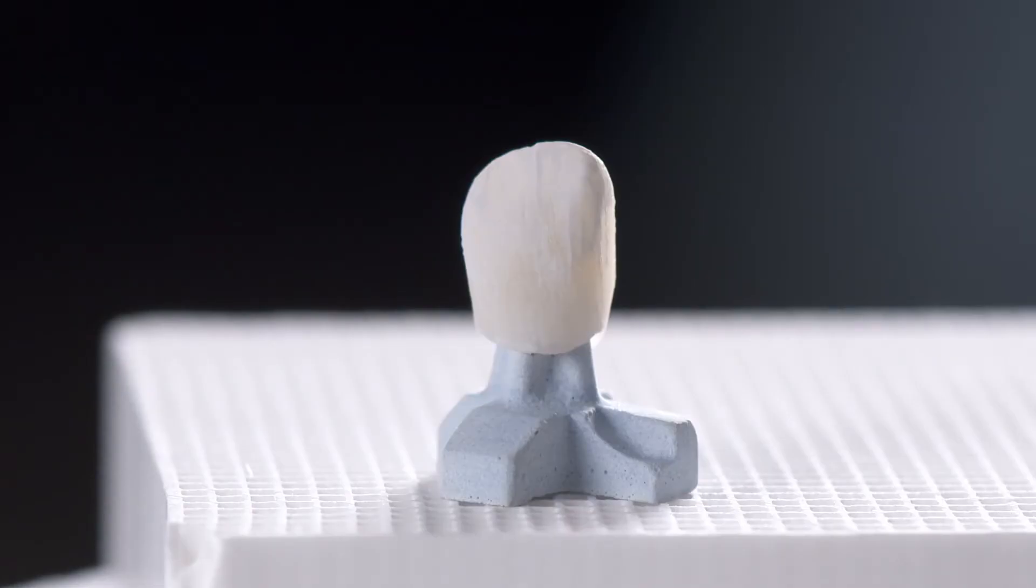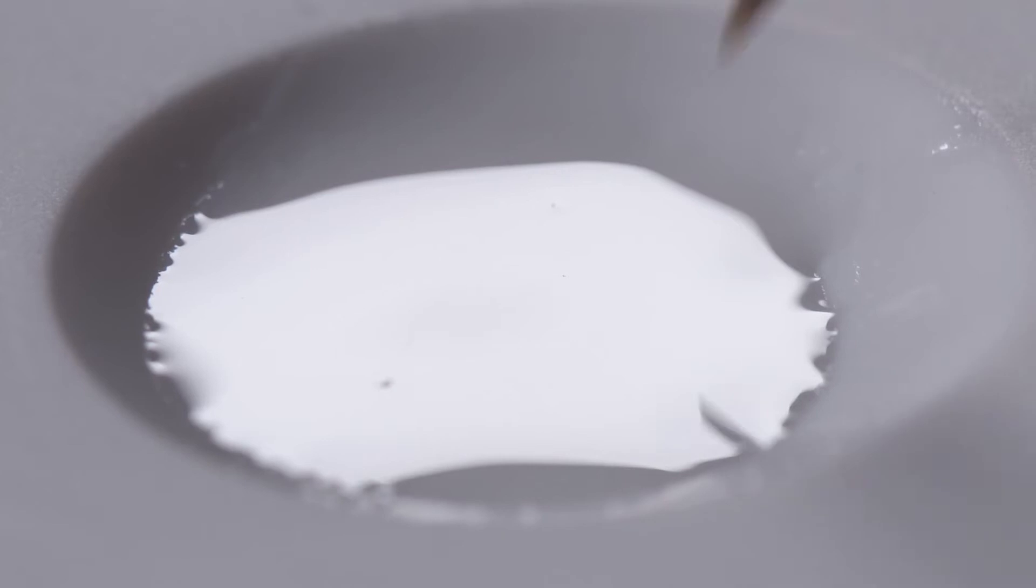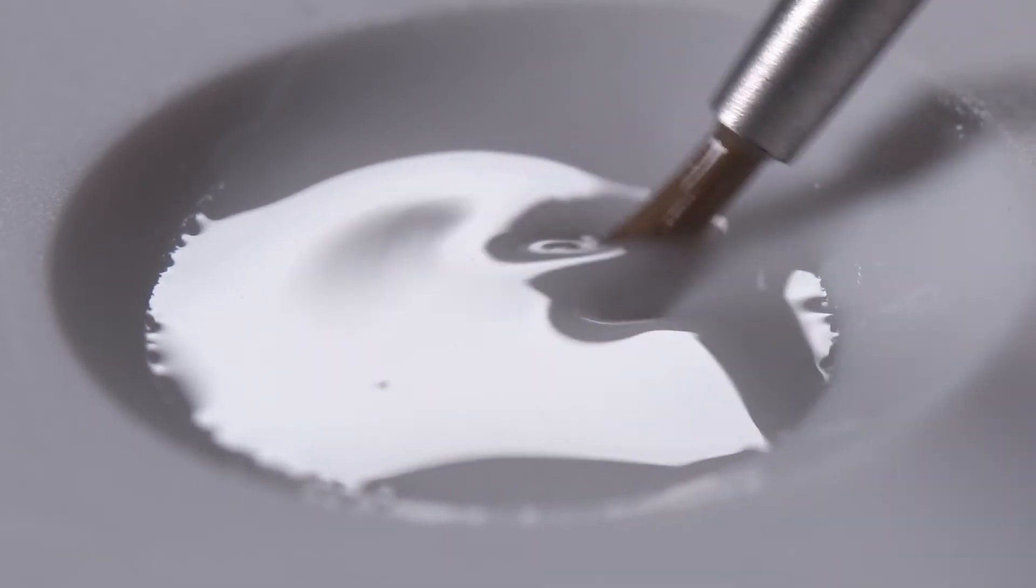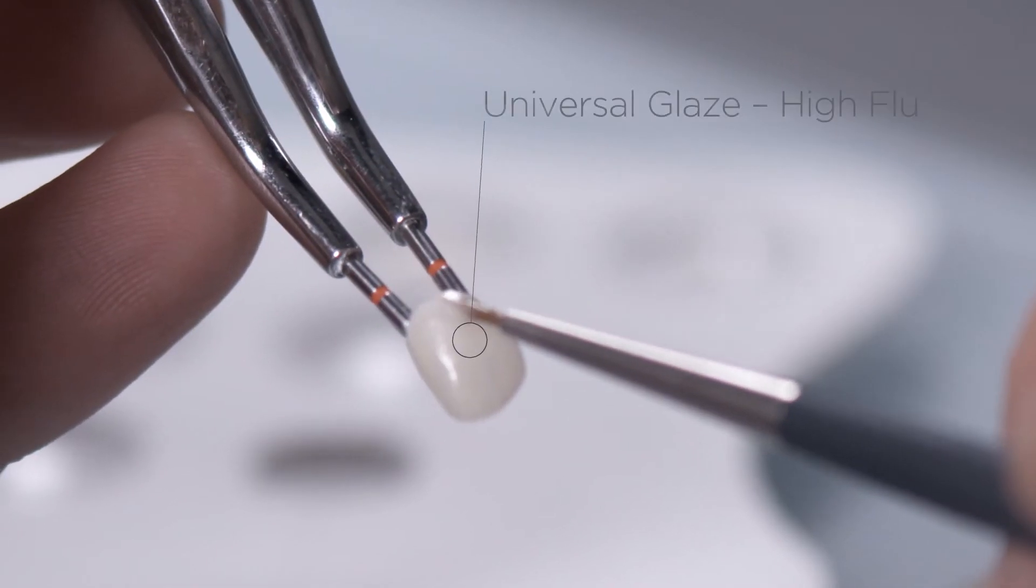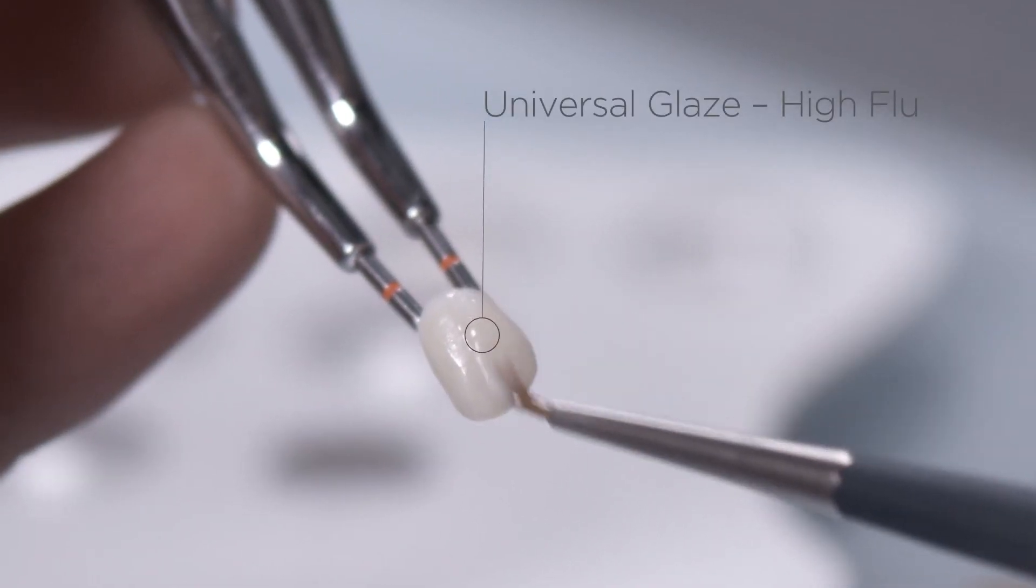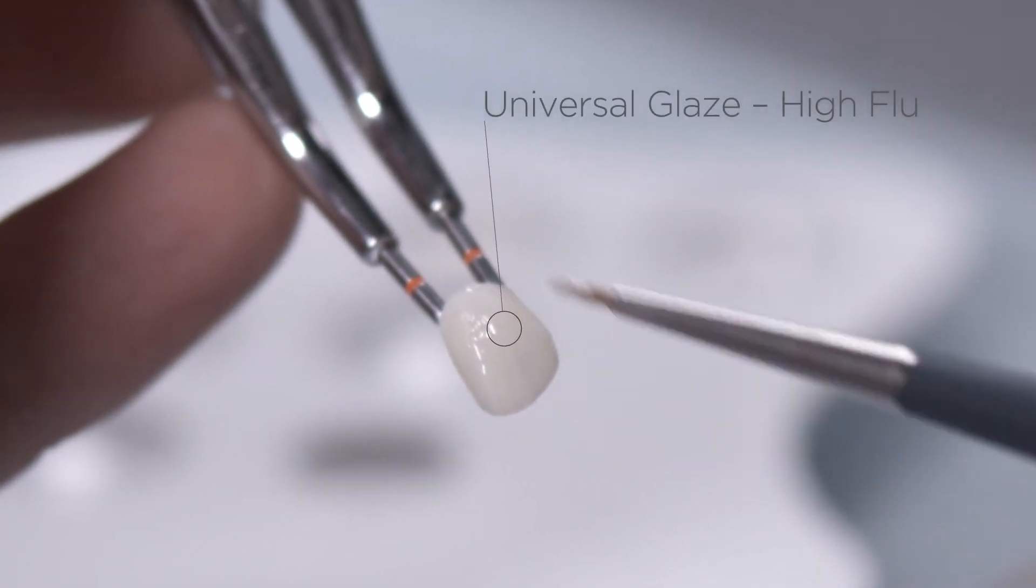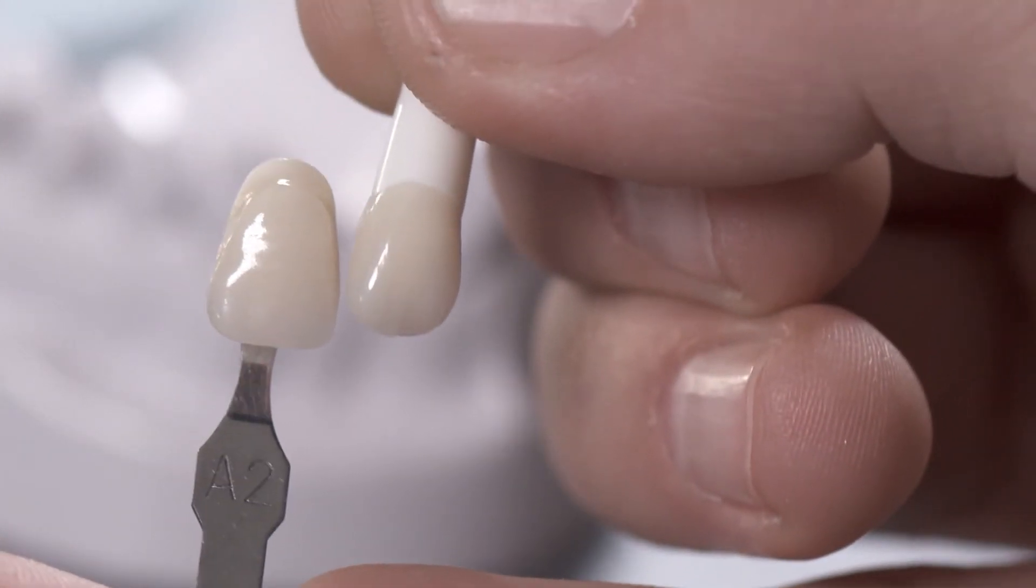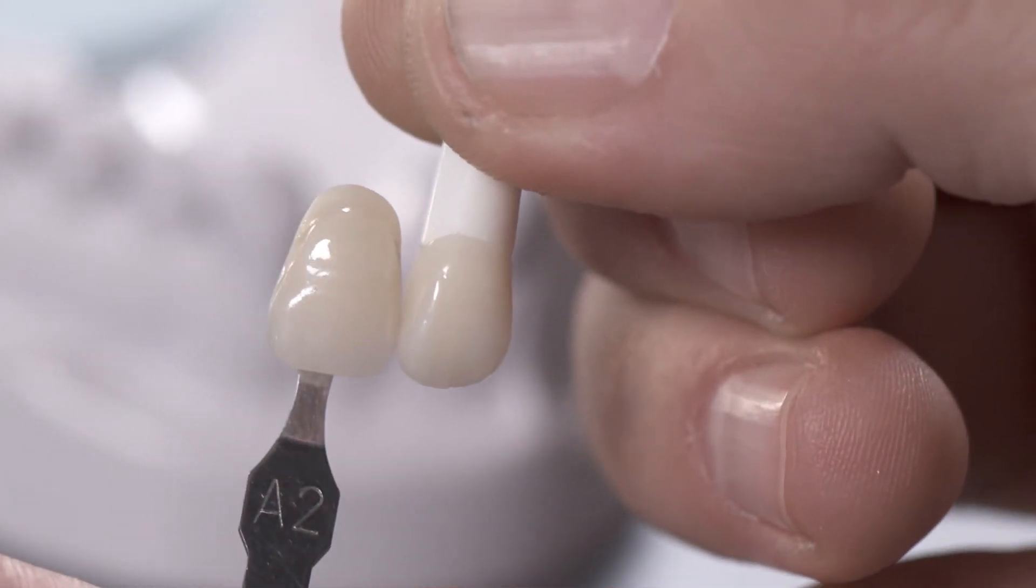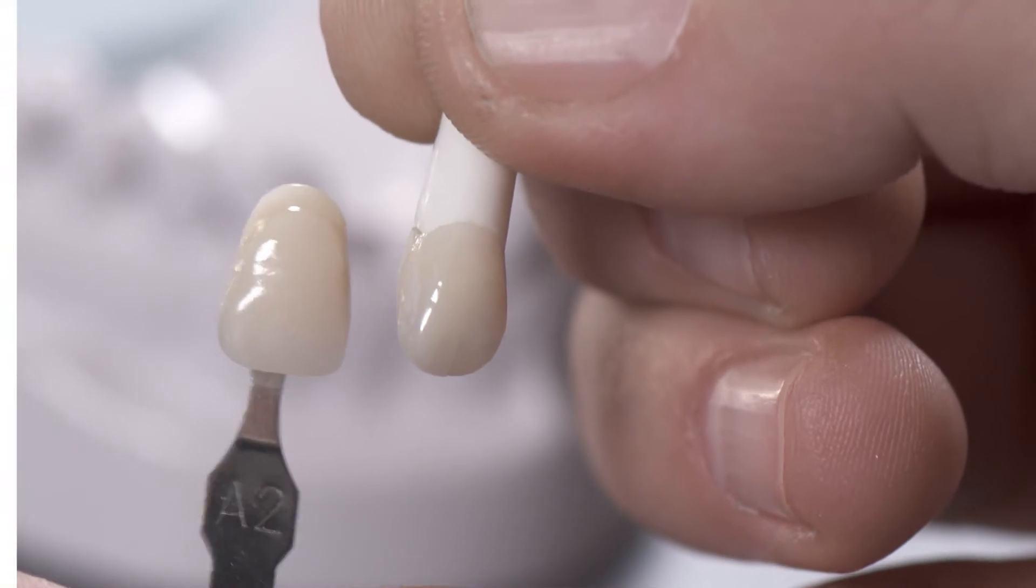After stain firing, only High Flu Universal Overglaze is applied across the monolithic restoration. The final shade check against the shade tab confirms the quick and easy shade reproduction with great aesthetics.